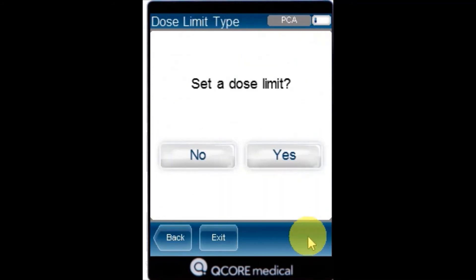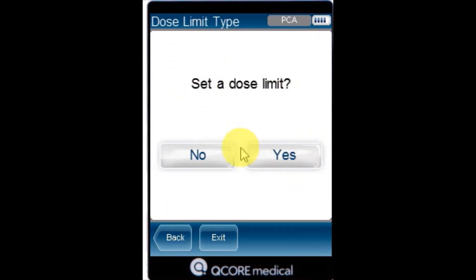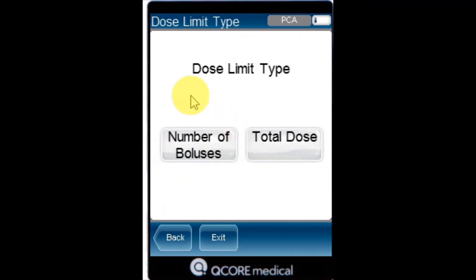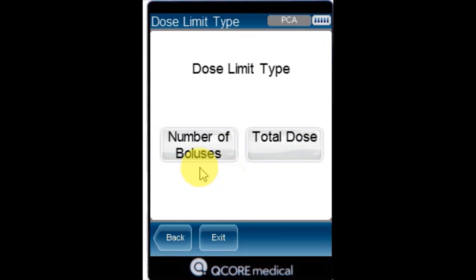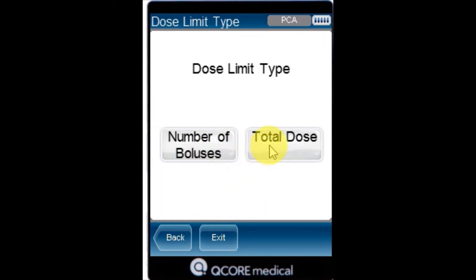From the dose limit type screen, specify whether the bolus available for the patient should be limited. Press Yes. From the dose limit type screen, select the type of limit to apply for the infusion and proceed to the directed step. Select Total Dose.